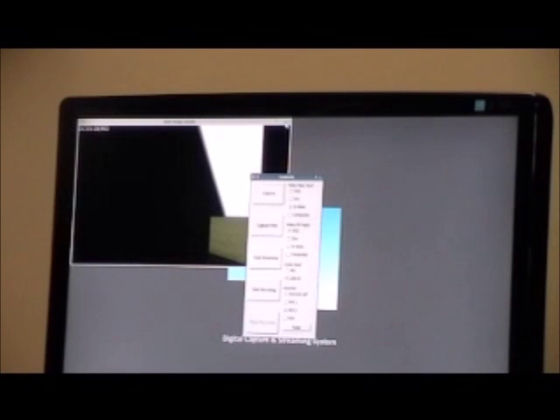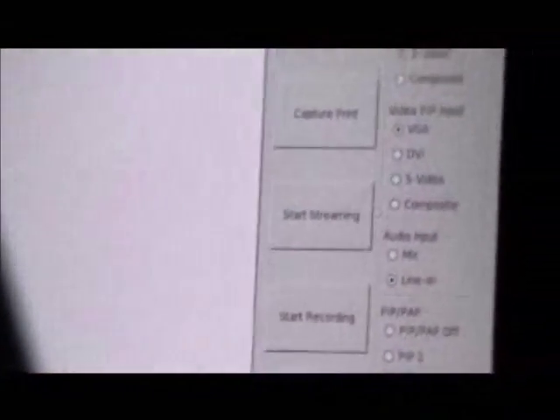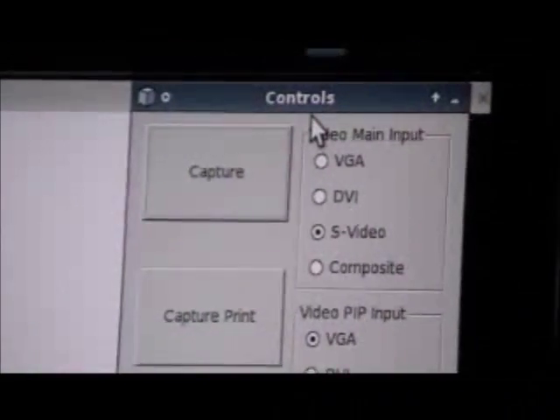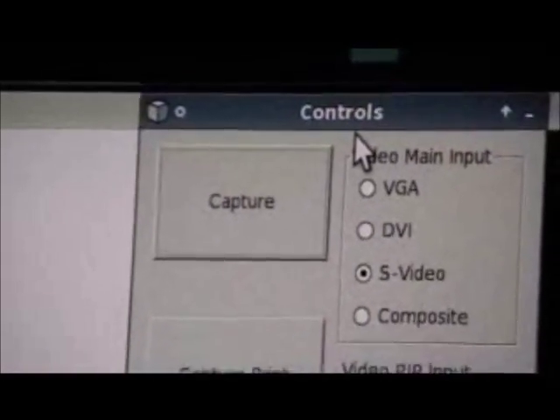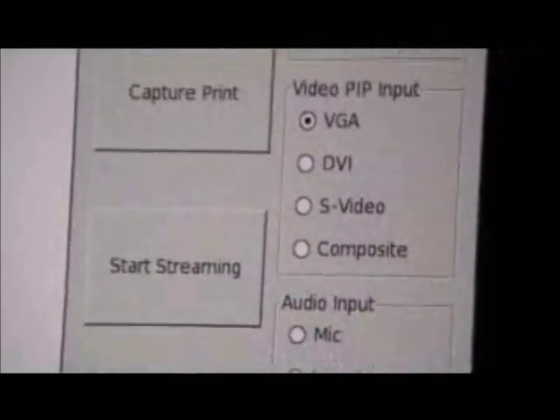So we'll go ahead and enlarge this screen first, bring our controls back up, and what we can do here is we have dual source recording and image capture simultaneously. These two sources are locked together, so you'll have dual views at any point in time during a procedure for still images or for motion video capture segments.